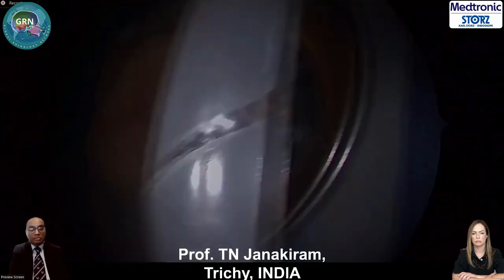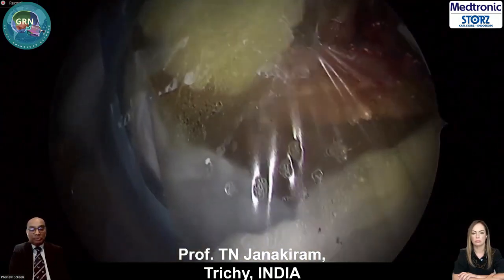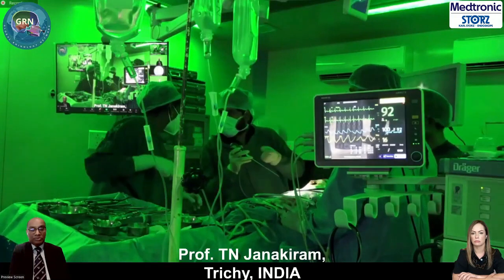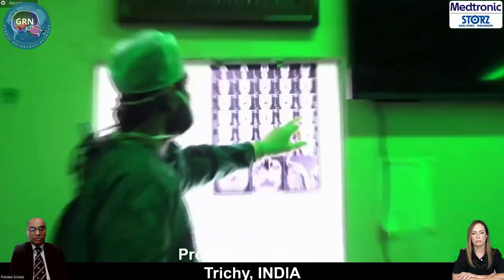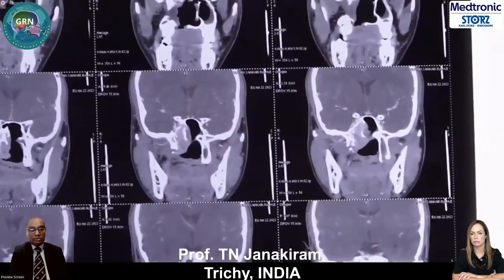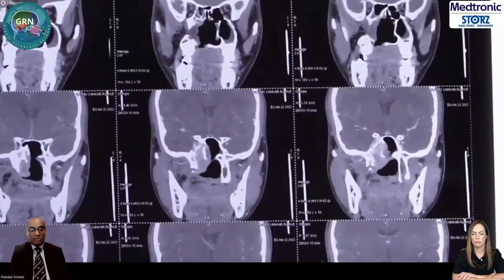I'm just going to show you in the scan what it correlates with. Can you show me the scan, please? Yeah, see here. So, see here, this is a tumor. Give me a pointer. I will show you the scan and correlate with what I have done. To correlate with what we have done is very, very important.